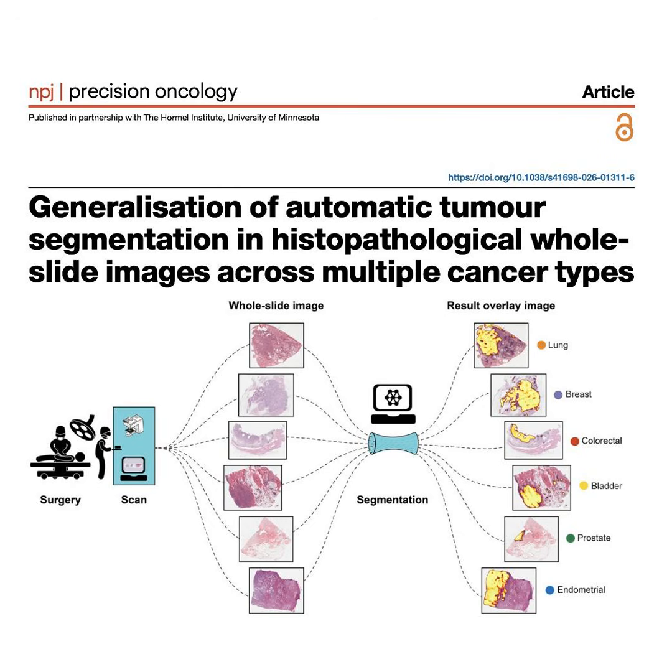But understanding that it works is very different from understanding how a computer physically ingests and processes something this large. Right. Let's look under the hood at the anatomy of this algorithm, because a whole slide image is not a standard JPEG that you snap on your phone. No, not even close. These files are gigantically dense. Like, how big are we talking? We are talking about dimensions up to 100,000 by 100,000 pixels. That is insane. It is.